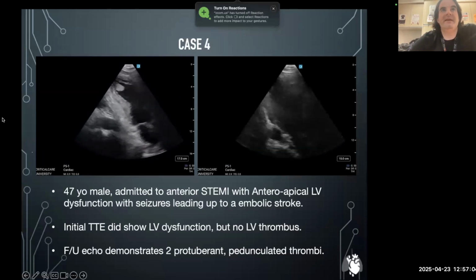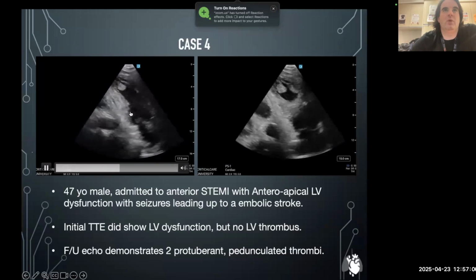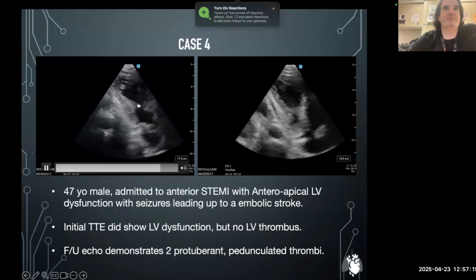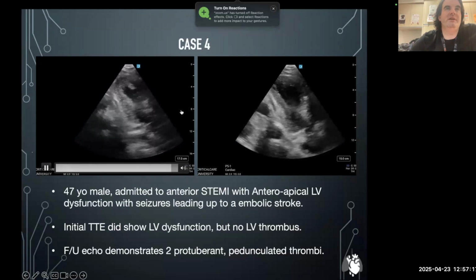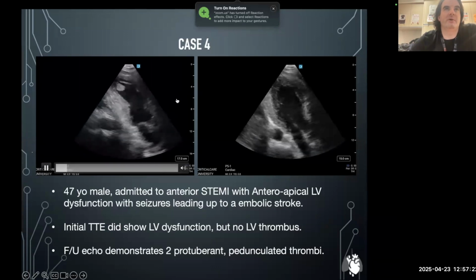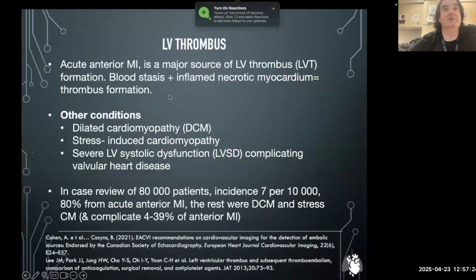So same principle. And then here too, you can take a view where you decrease the depth. So say you go to 5 centimeters, for example, or 8 centimeters, where you're just focusing primarily on the LV, it can give you just better resolution. So here, these are a bit deeper, but if you reduce the depth, you might get a better quality image. And also if you narrow the sector width as well, it can help with your resolution and frame rate.